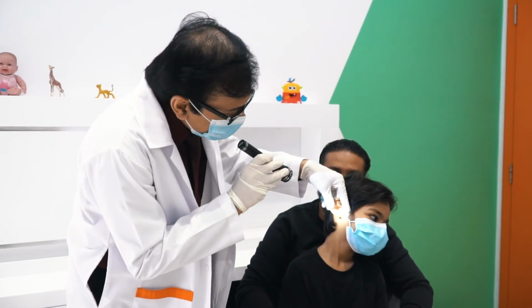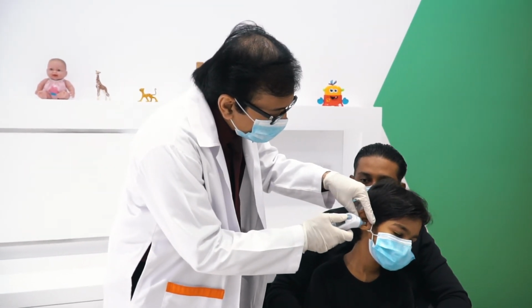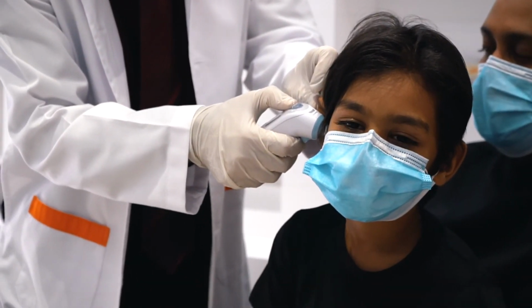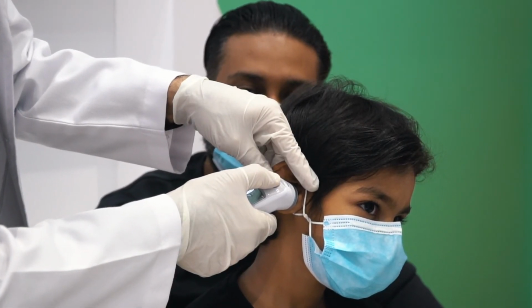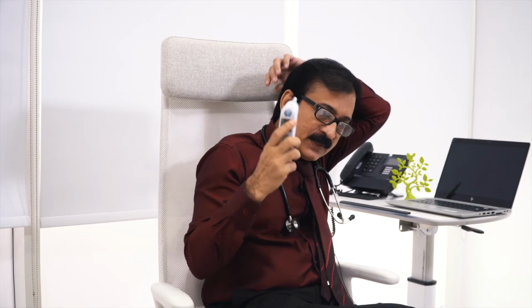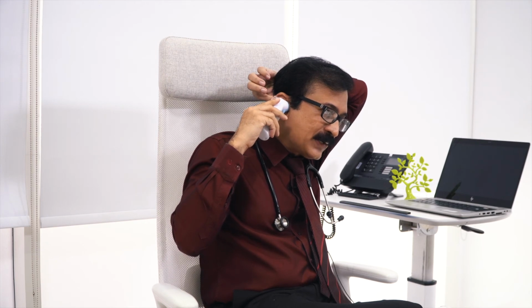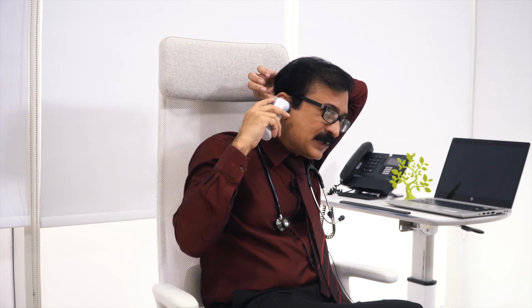Now let us see how to measure the temperature in the ear cavity. So first thing is we have to explain the procedure to the parent, or even to the child if it's a bigger child. We are measuring only and it will not hurt him. Otherwise, children may suddenly shake the head, they will get irritated and they may injure the ear. So first of all, hold the pinna of the earlobe and pull it slightly backwards and upwards like this. Then you can introduce the probe gently so that it goes almost up to the inside of the ear. Then only press the button for measuring the temperature, and it will be done very fast.